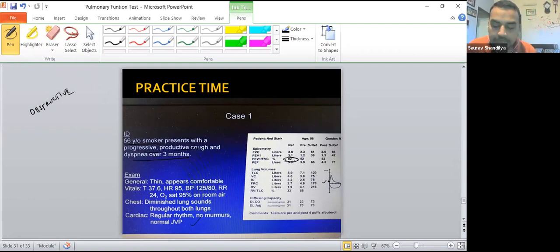Apart from that, can you see anything else here? Now, apart from coving, anything else you can see here? You have to see FEV1, FEV1 to FVC ratio, as I told you. Let me see, anybody can answer me. Anything else you can see? So I told you after FEV1, FVC, what we have to see, and this is something we have seen, right? Now FVC, you see here, what is that? Okay. So after that, we have to see FVC.